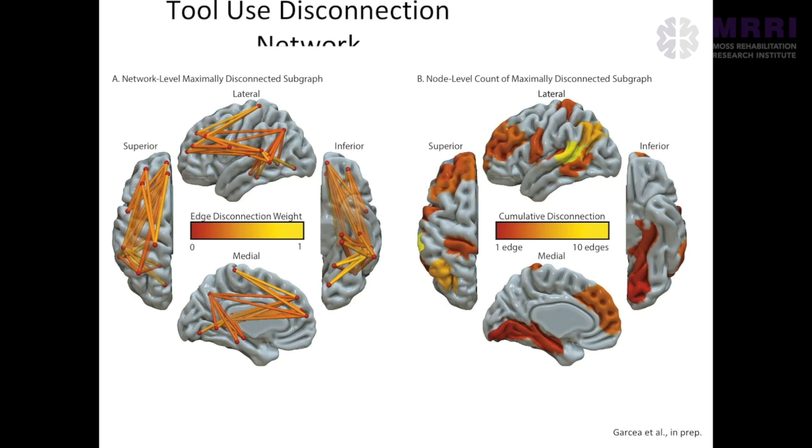So what I did as a control was the same analysis I'm showing you here, but with right hand grip strength, controlling for left hand. So what I want to see is abnormally weak right hand grip strength, right? And where does that localize? So you can look at individuals who are abnormally weak with the right hand compared to the left. That localizes to the cortical motor system, but also in subcortical regions and in and around the cortical spinal tract. And when you do the same approach with the connectome lesion symptom mapping, you see similar disconnection patterns.